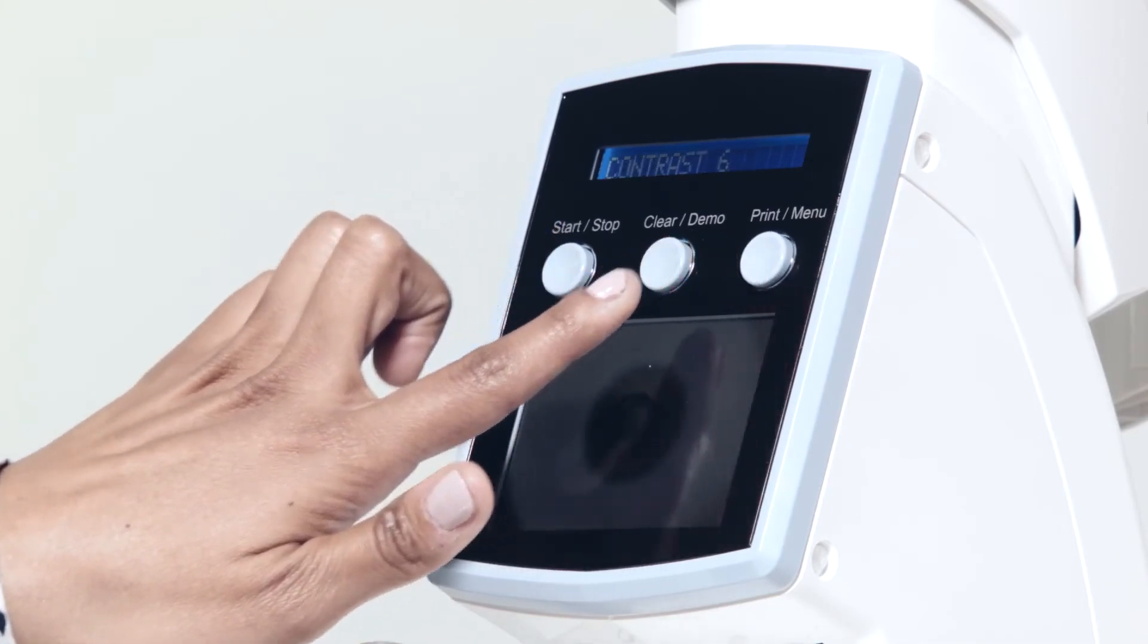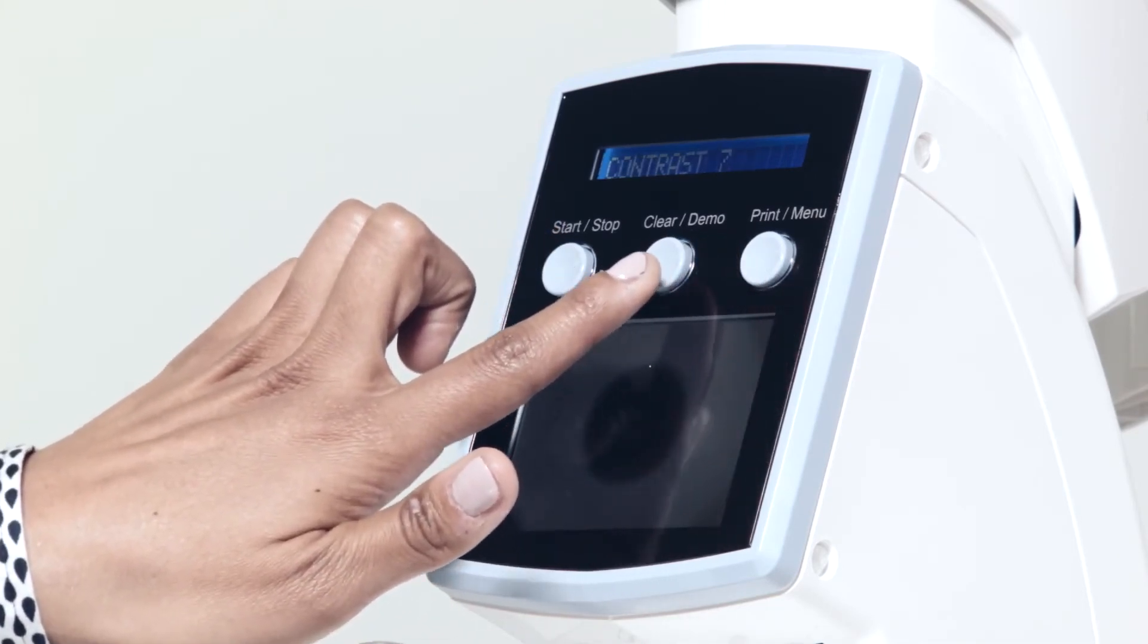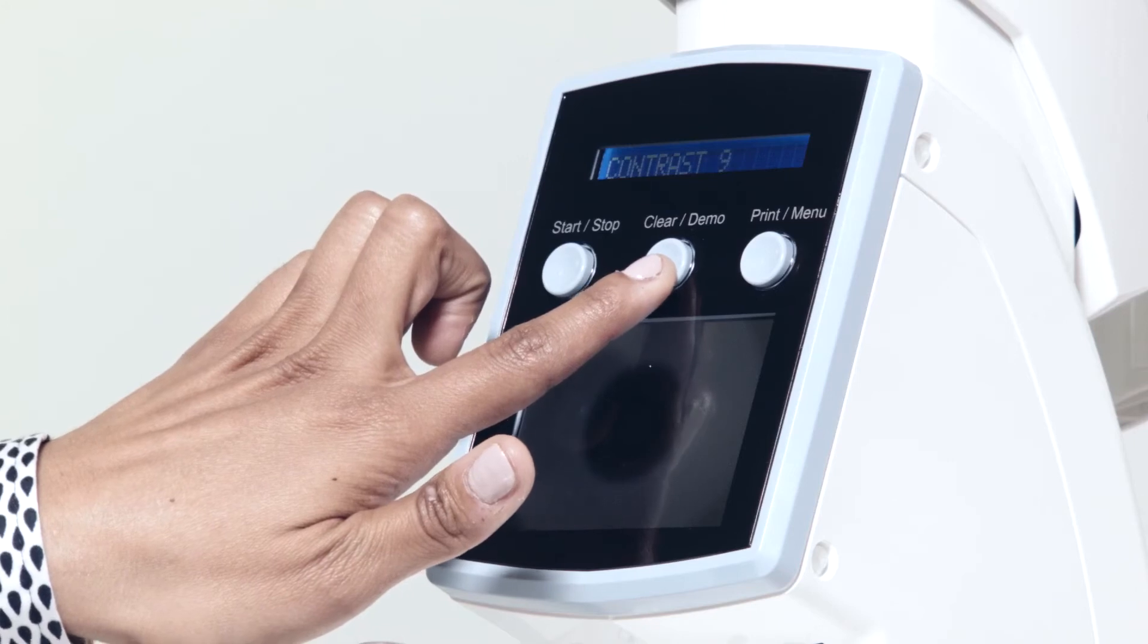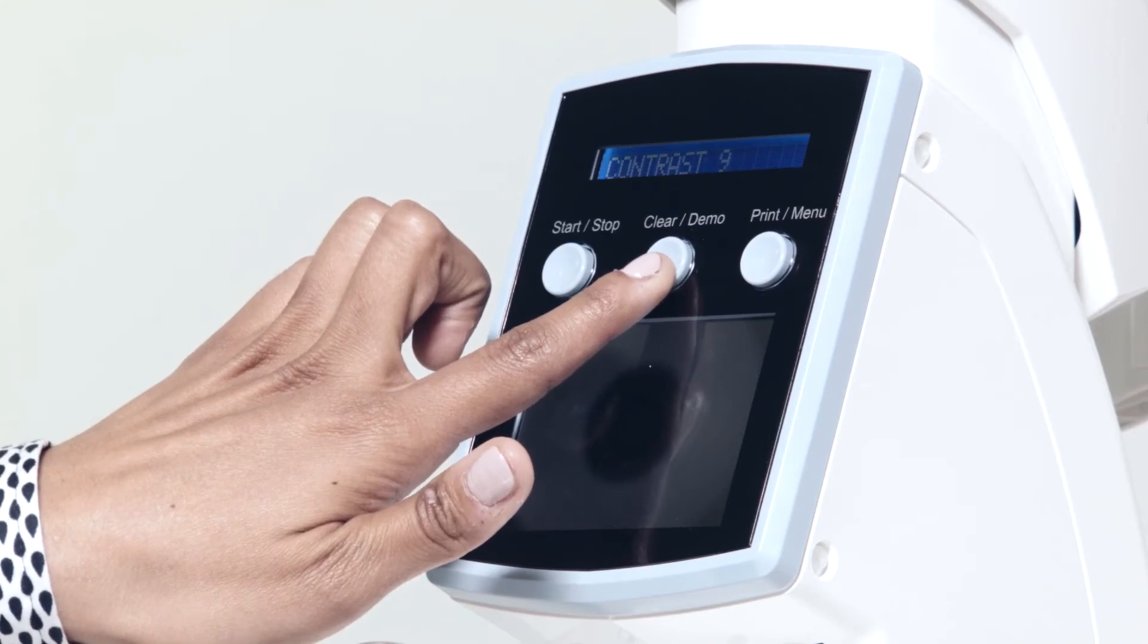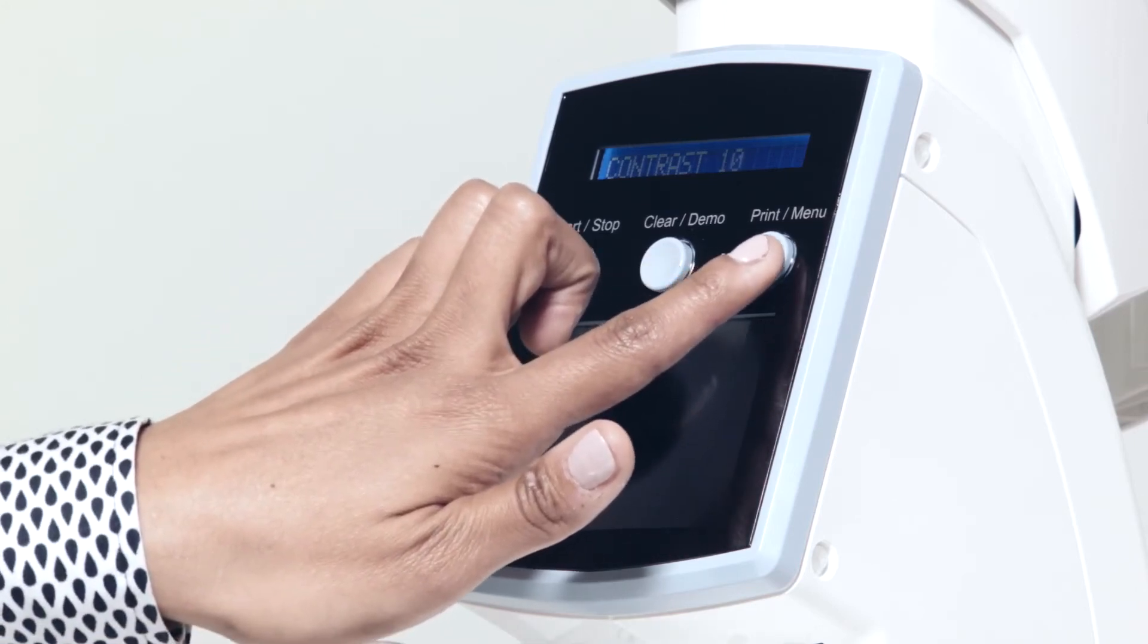Here, you can select Buzzer On or Off, IOP Format, Display Screen Contrast, and Full Self Test.